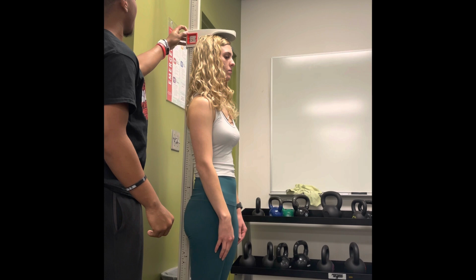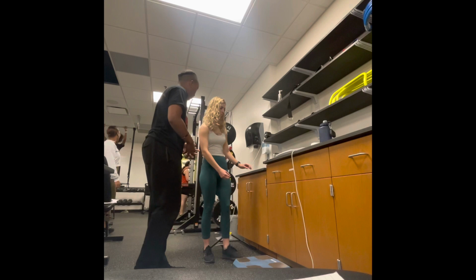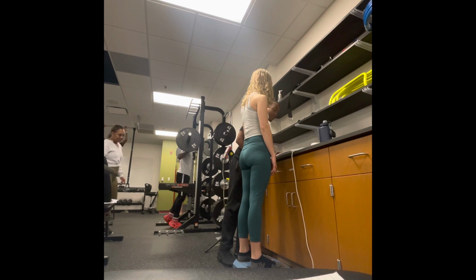Perfect. So what we're going to do here today, we're going to take your weight. This is the other half of the equation for your body mass index. So what I'm going to have you do first, take your shoes off for me. We're going to go ahead and step up here on the scale, put both feet flat on there, and stand there for me. That was great, right? Yeah. Alright, we'll go ahead and step off for me.